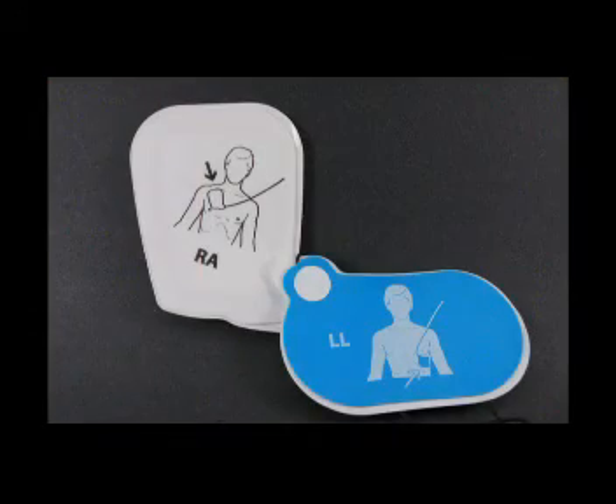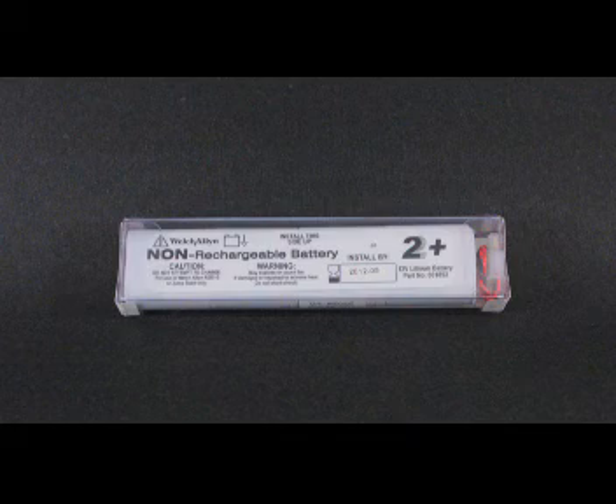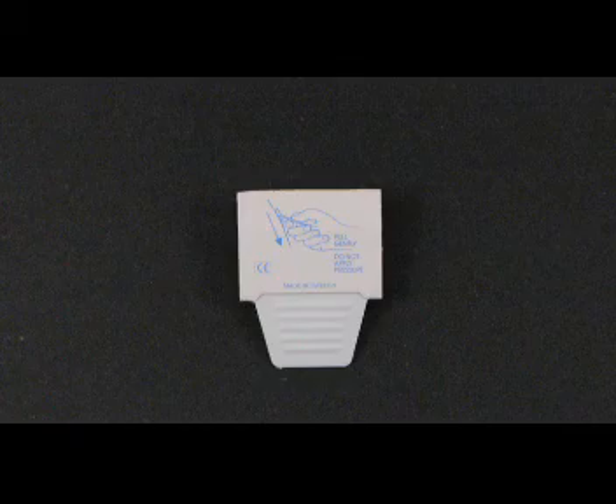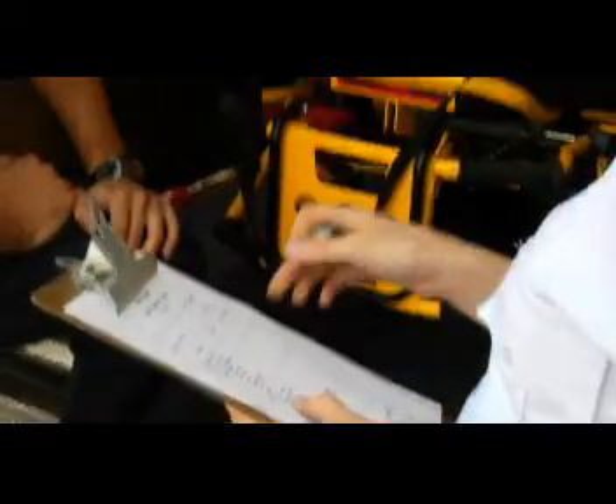The AED should be ready to use, located near trained rescuers. Accessories such as extra pads, pediatric pads or adapter, an extra battery, CPR barrier, a towel, gloves, and a razor should be stored with the AED. Make sure the AED is ready for use. Follow manufacturer's guidelines for regular inspections. Make sure expiration dates on the pads and batteries are current, and there is no visible damage to the unit.